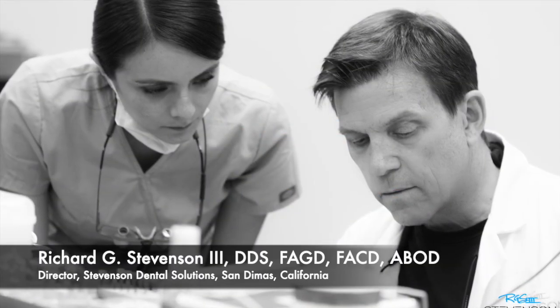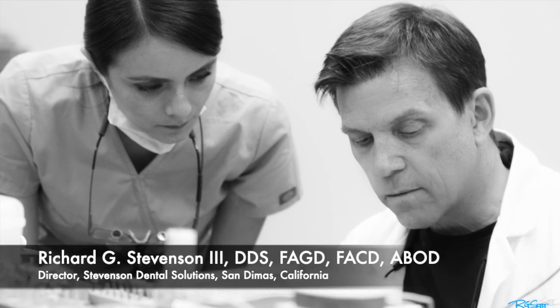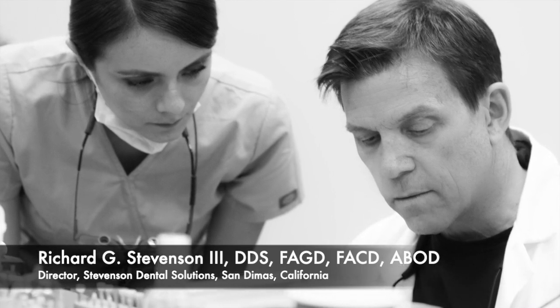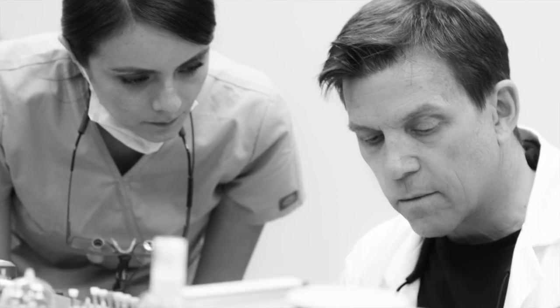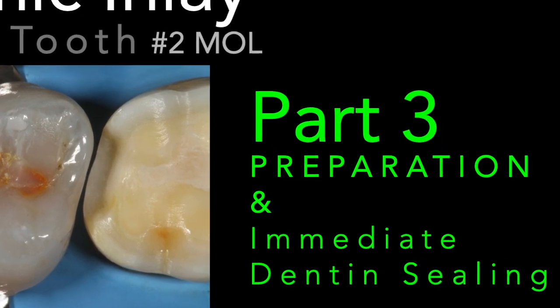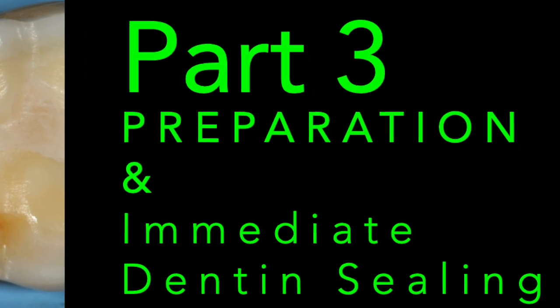Hi everybody, I'm Dr. Richard Stevenson and I'm the director of Stevenson Dental Solutions in San Dimas, California. We're a teaching center dedicated to hands-on courses to improve your skills and knowledge, and today we are going to tackle the ceramic inlay. We're also going to discuss immediate dentin sealing and I'm going to show you the technique that I employ for this important step.